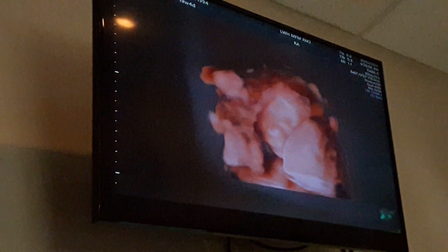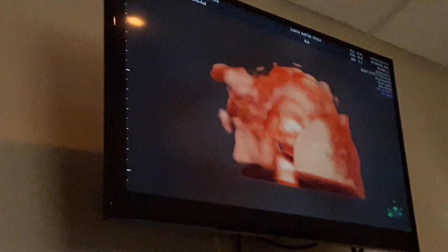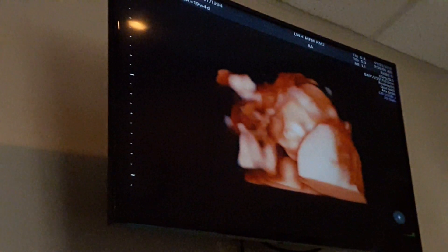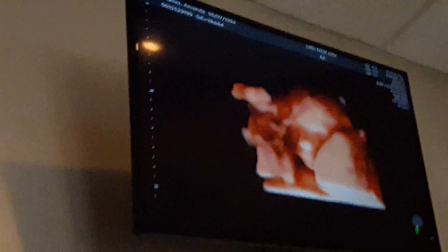Wow, look at that. Oh my goodness. So the eyebrows and the eyelashes and all that are developed here? I mean, it is, but not very. You're fine at this point. It's so cute.